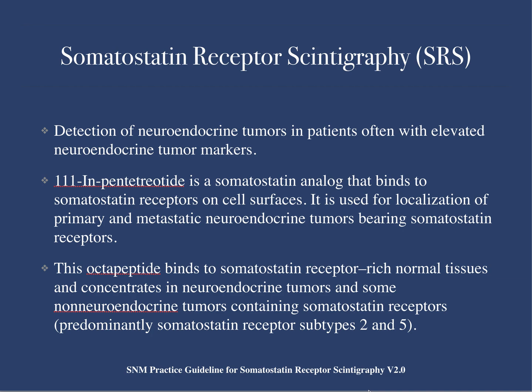Welcome back. In the last part of today's lecture, we're going to talk about somatostatin receptor scintigraphy, and this relies on overexpression of somatostatin receptors on many neuroendocrine tumors. And the original molecule that was used for imaging is pentetreotide that was labeled with indium 111 to enable the localization with the gamma cameras.